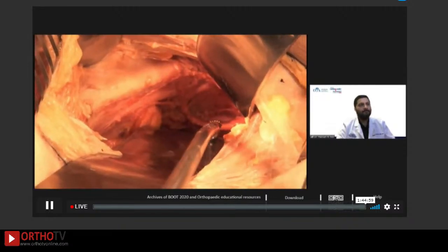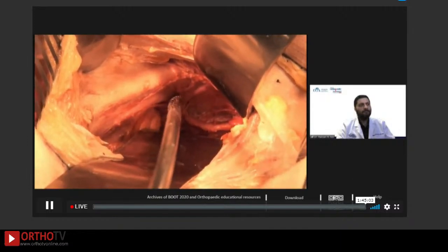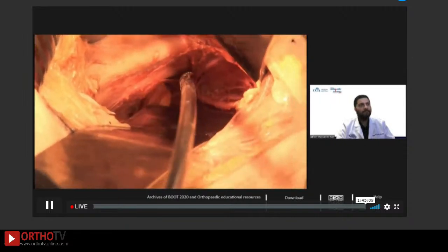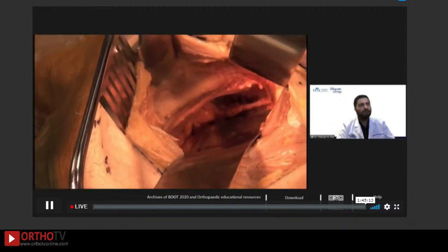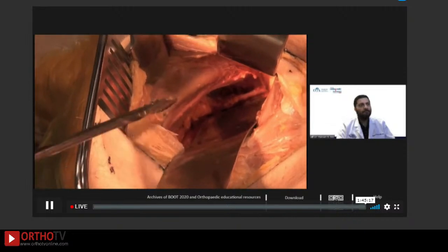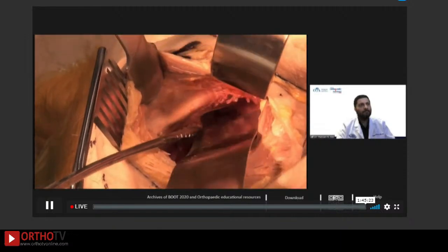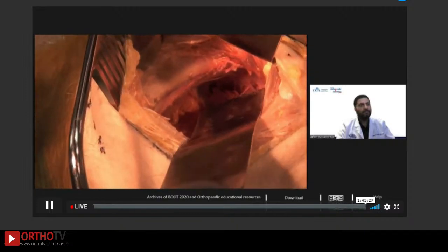The obturator neurovascular bundle is identified as it courses anteriorly to exit the superolateral portion of the foramen. Corona mortis connections are identified, which are ligated with vascular clips prior to further lateral dissection. The malleable retractor can now be repositioned to protect the obturator bundle as we dissect posterolaterally along the pelvic brim and quadrilateral surface. The obturator internus muscle belly is elevated to expose.